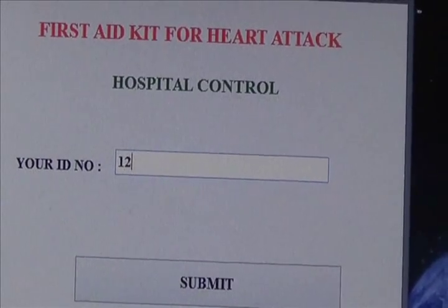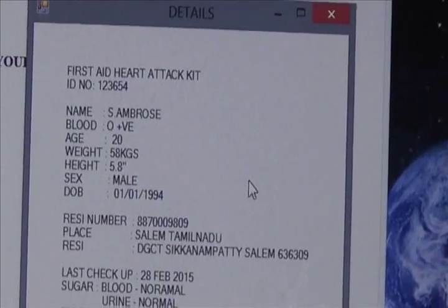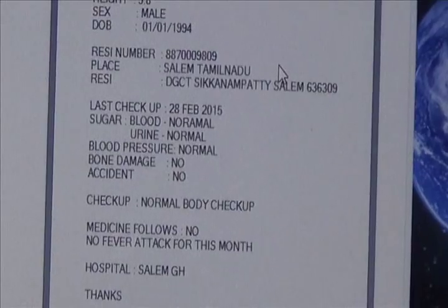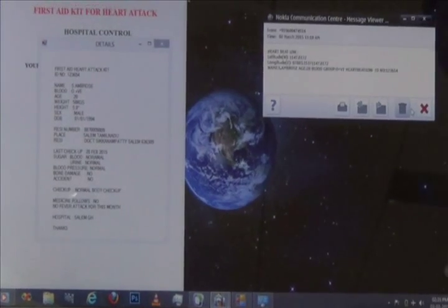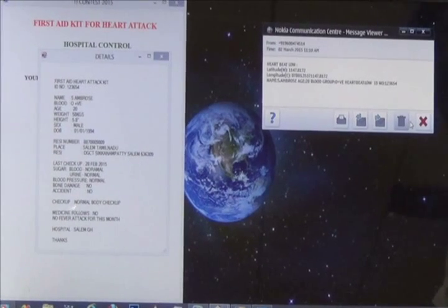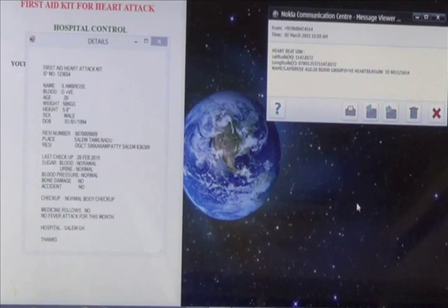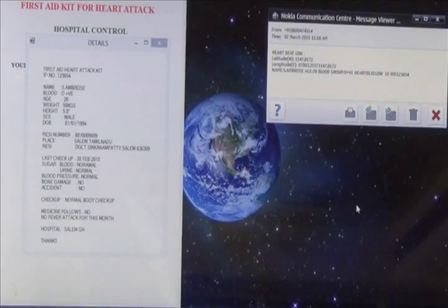The ID number shown is 1, 2, 3, 6, 5, 4. It automatically displays the full details about the patient including contact number, resident place, and further patient history. The longitude and latitude values are tracked by the GPS kit and sent via SMS. The coordinates are entered directly into Google Maps to find the patient's current location, and an ambulance is dispatched from the hospital control room to that location.